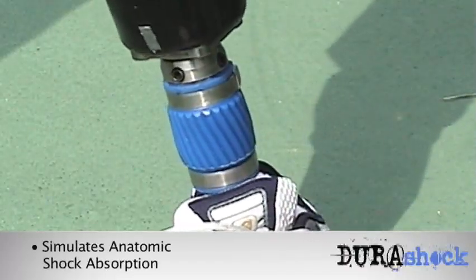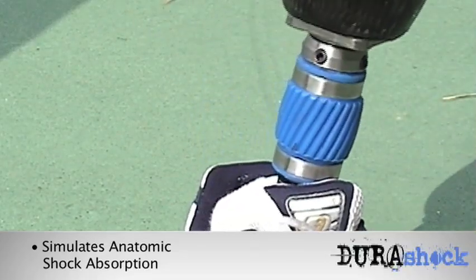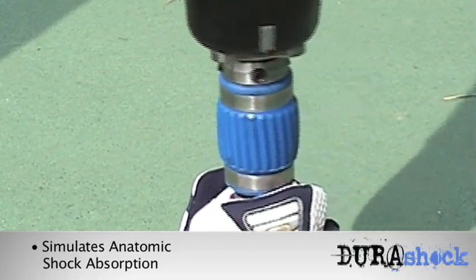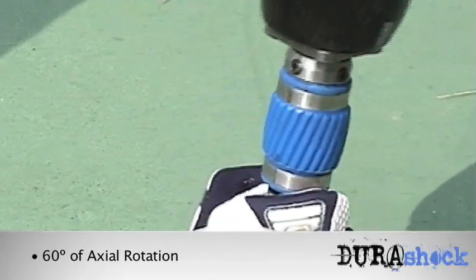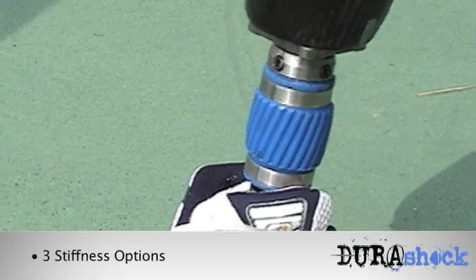What I really like about the rotation of the DuraShock Pylon is that it feels very natural. It's a progressive type of rotation — the further I rotate, the more resistance I get. When I first start to rotate, it's almost free motion, and the further I rotate out, the more resistance I get.